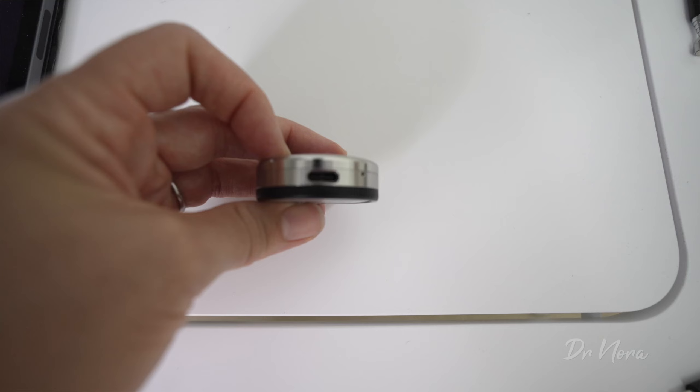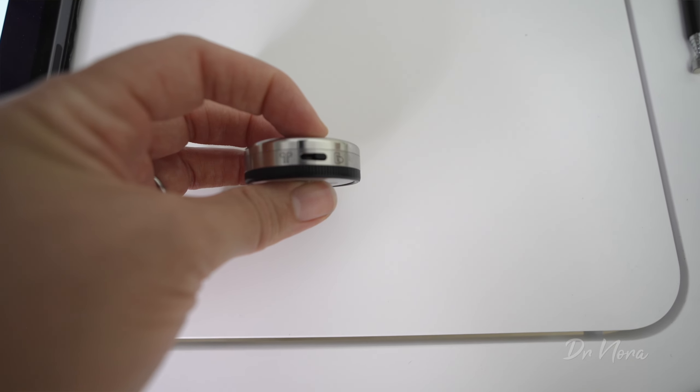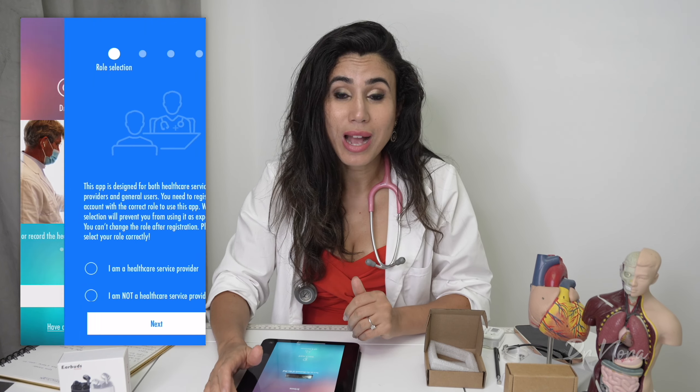But more on that later, because first we need to look at its features and pair it up with the app. On the side it has a charging portal and a little toggle where you can switch it on/off or listen via headphones. Once charged — which doesn't take too long — you can simply take it home at night, charge it up, and bring it back to work.